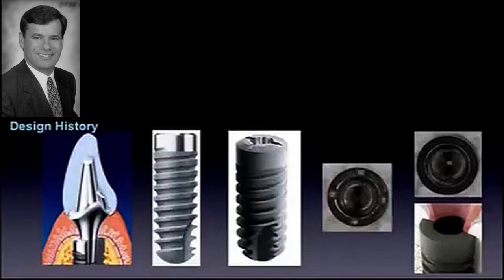there is indexing inside the implant. So the CX design has indexing. It has no notches on top, a very smooth surfaced platform that's coated. So my experience was years ago when it was a polished collar, you could place this implant supracrestally. You could place it equicrestally when it had a polished collar. But my experience now is this implant is strictly a subcrestal implant. And when placed at the crest or supracrestally, I think you're asking for trouble.